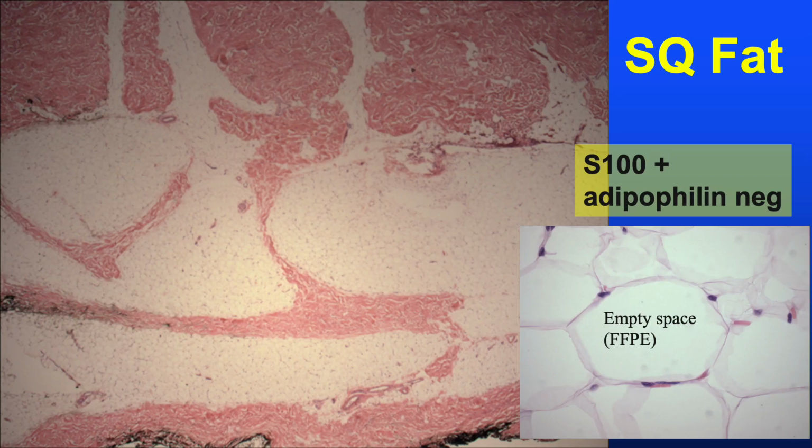Turning our attention to lipomatous tumors, let's first take a look at normal subcutaneous fat tissue. We have lobules of well-differentiated fat cells known as adipocytes or lipocytes, separated by collagenous septa. Septa is the plural, present in continuity with the overlying collagen in the deep reticular dermis.